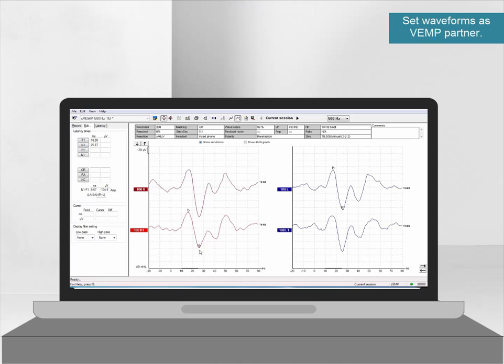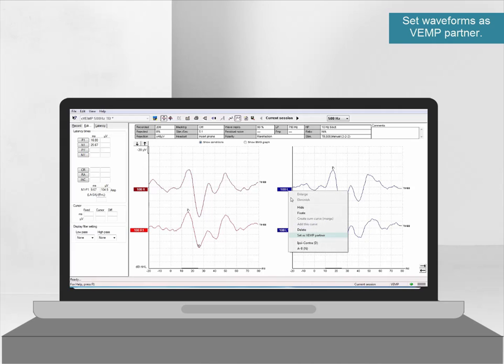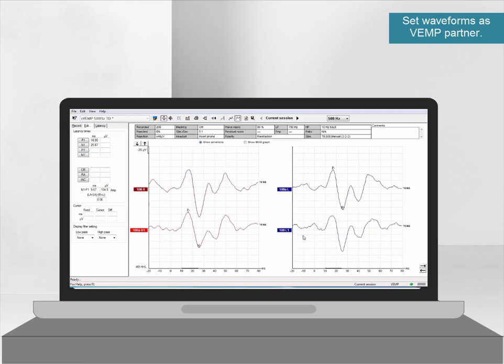Lastly, the waveforms should be paired together. With one waveform selected, right click the waveform handle of the opposite ear and select set as VEMP partner. These selected waveforms will then be used in the asymmetry calculation.